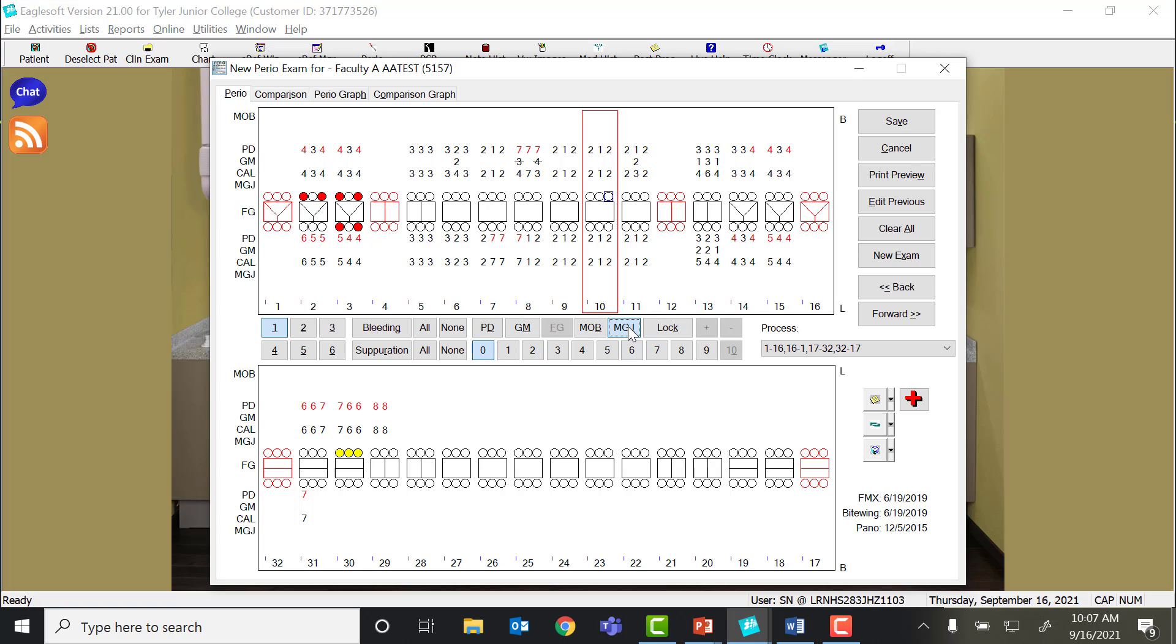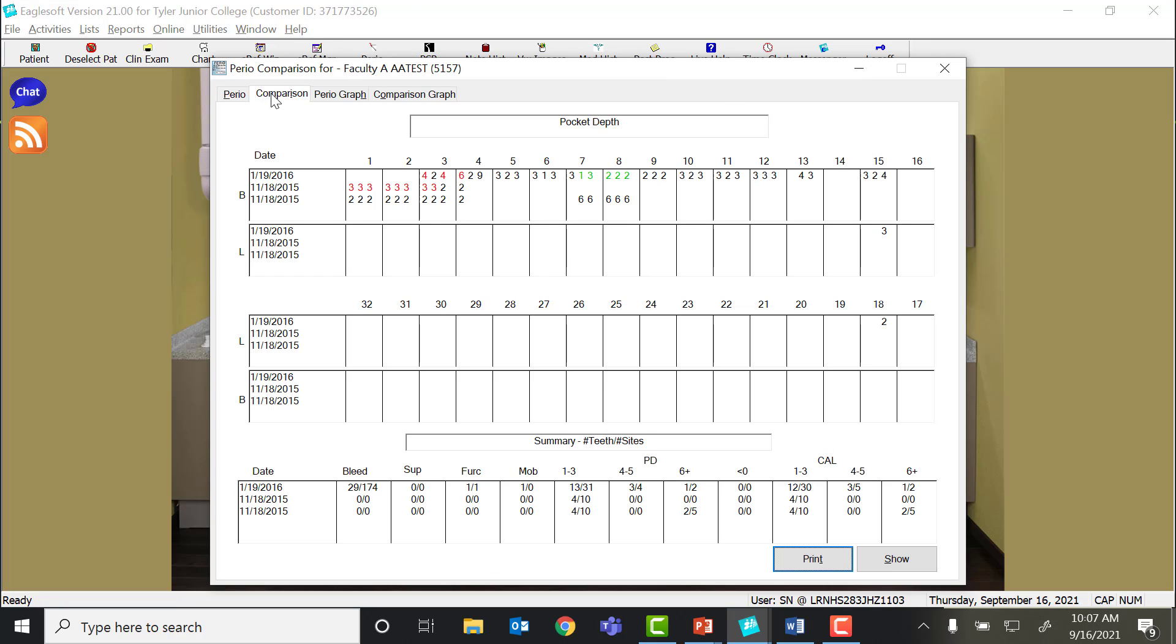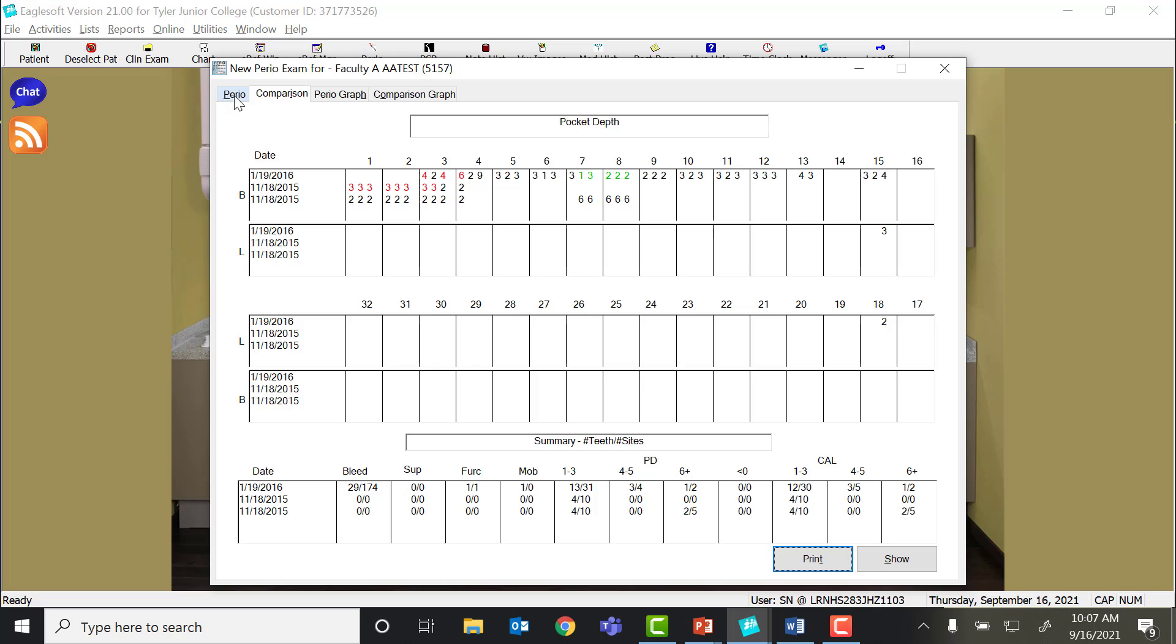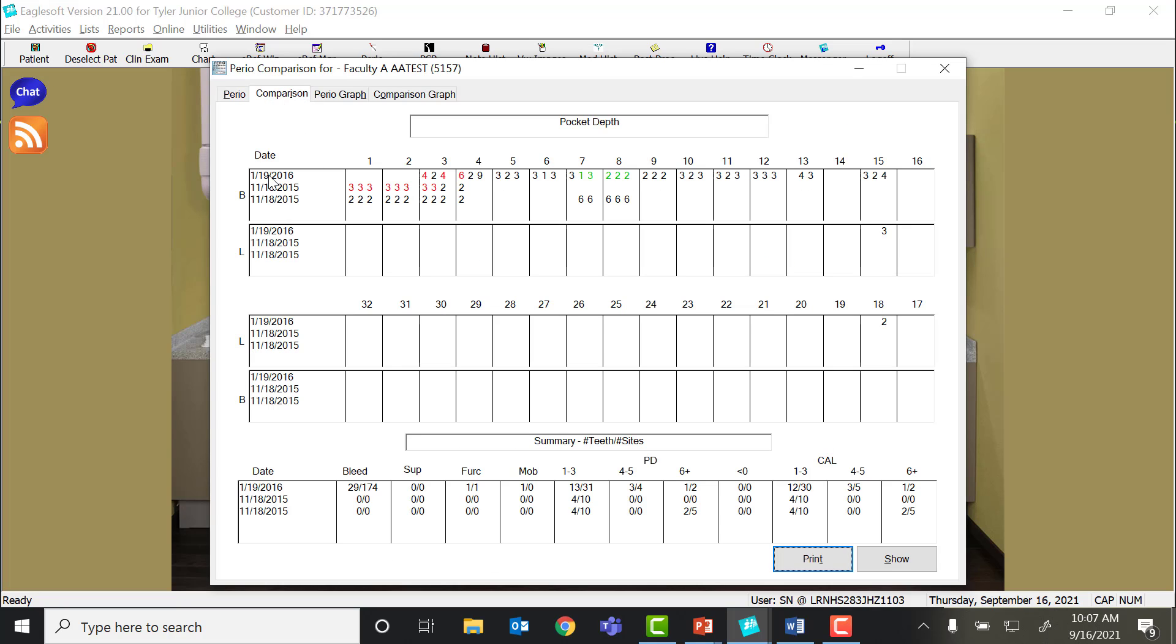Mucogingival junction, we do not require you to measure. When you are seeing your patient back at their re-care, say it's a perio patient, you're seeing this patient every three months, the comparison option allows you to pull up all the probe charts this patient has ever had. And it gives you the numerical value so you can see progress.